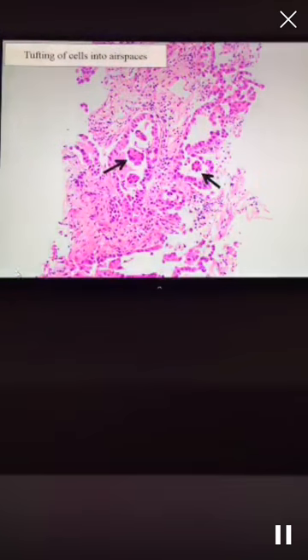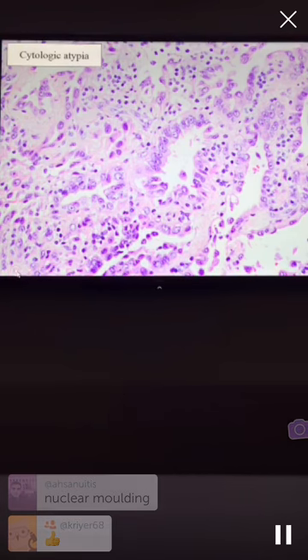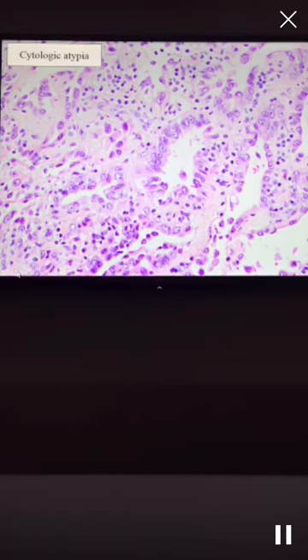All right, next. Here's another example of micropapillary growth pattern that establishes that something is malignant. So this establishes a malignant diagnosis. Cytologic atypia, of course we look at that, but you know this is in the eye of the beholder. Everybody has different thresholds as to what is cytologically atypical, but of course we use that. That's one of the key features in determining something is malignant or not.